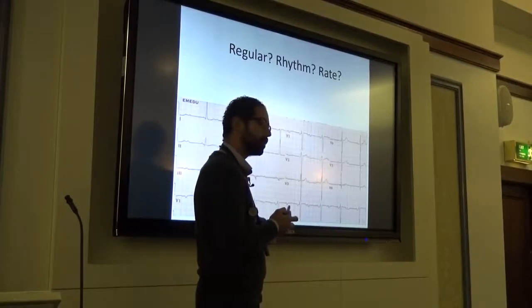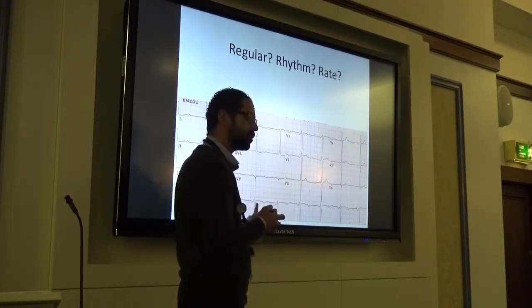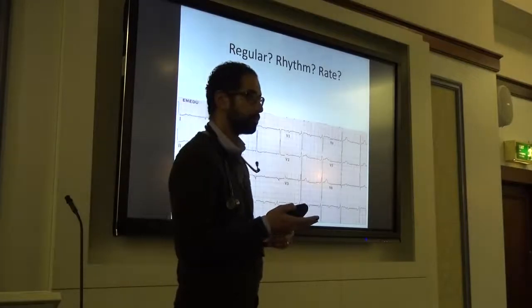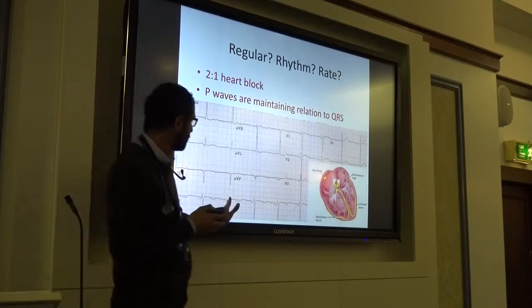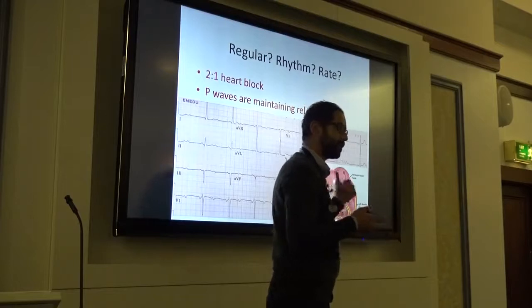1, 2. Yeah? Can you guys see that? P wave, QRS 1, 2. P waves, QRS 1, 2. So what's that? Excellent. So what would you call this? Excellent. Good. And remember again that the P waves, when they occur, they are followed by the QRS. Right? And again, this will become clear shortly.